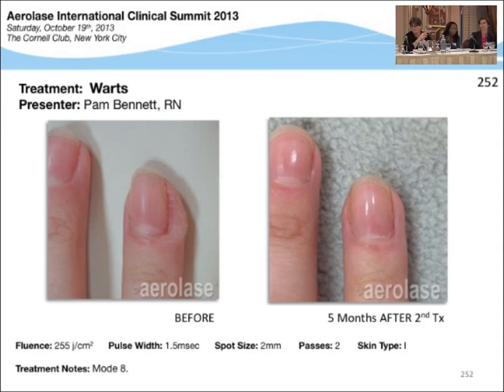I'll try anything because a lot of these patients are miserable, so I'll try anything and do these treatments every 2 weeks. Dr. Hepburn, do you use anything between wart treatments? Yes, I use multiple treatments. Sometimes I'll combine cantharidin with other treatments like laser or liquid nitrogen.